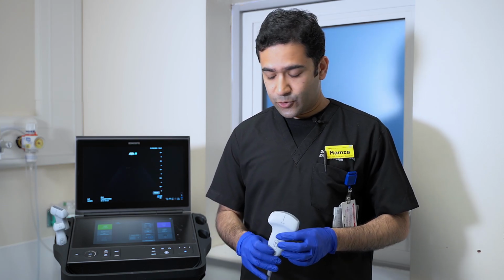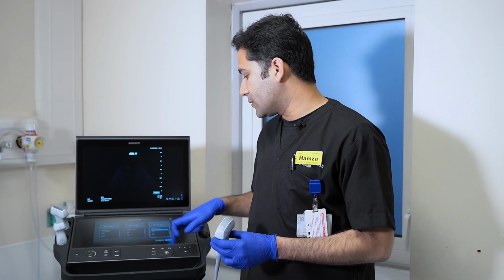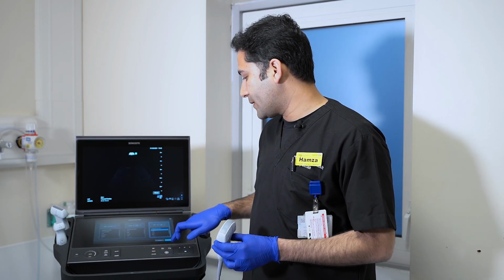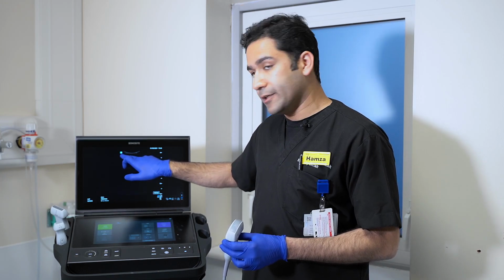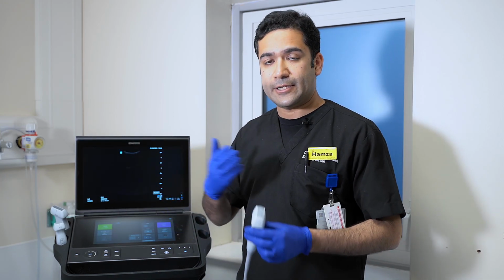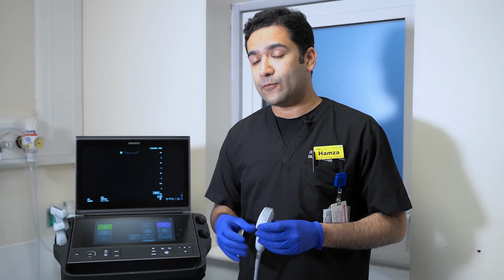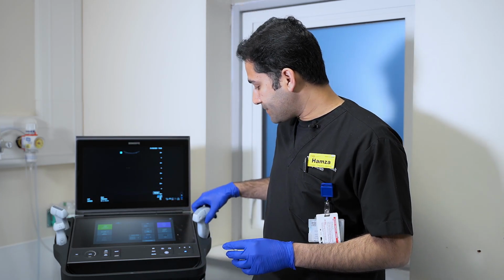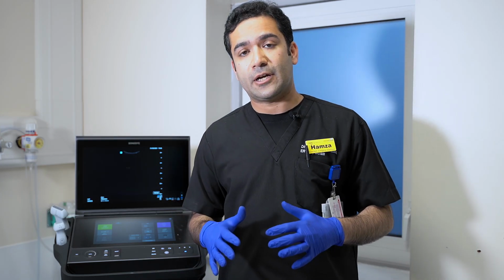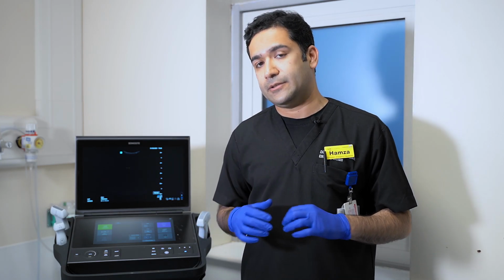And as you can see on the screen, once I've changed it to the abdominal or the fast preset, the marker on the screen goes on to the other side. That's why we have a slight difference in orientation, and that has something to be taken care of. Of course, that would depend from machine to machine that you're using. But nowadays, most of the machines are coming with this default setting, and that's how we take it.